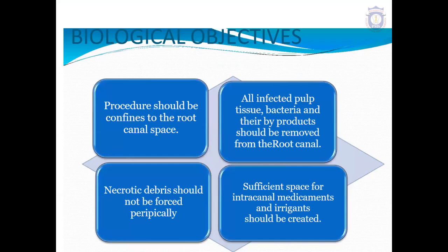Coming to the biological objectives, the procedure should be confined to the root canal space. All infected pulp tissue, bacteria, and their byproducts should be removed from the root canal. Necrotic debris should not be forced periapically. Sufficient space for intracanal medicaments and irrigants should be created.